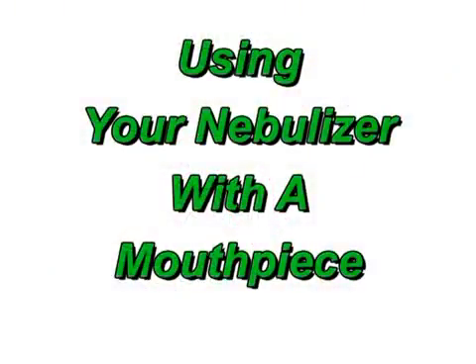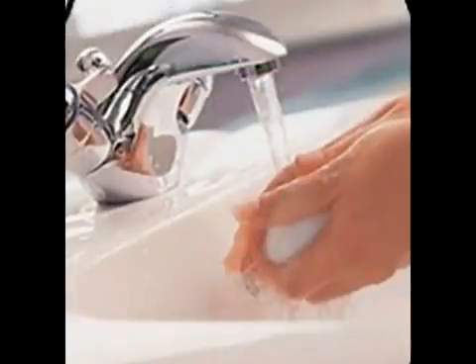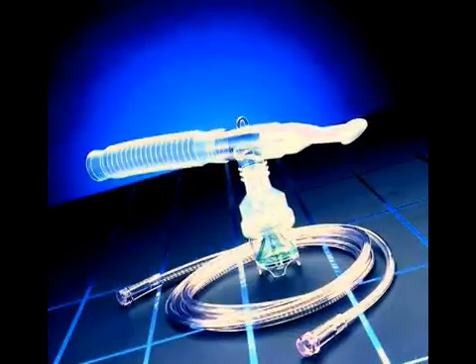Preparing your nebulizer for use. Remember to always wash your hands before setting up or using your nebulizer. The Salter number 8900 small volume nebulizer kit is packed with your Salter Air Plus compressor and is the unit that you should be using for maximum benefit from your medication. You should replace this nebulizer kit as directed by your supplier.